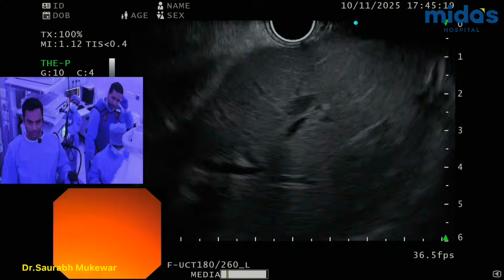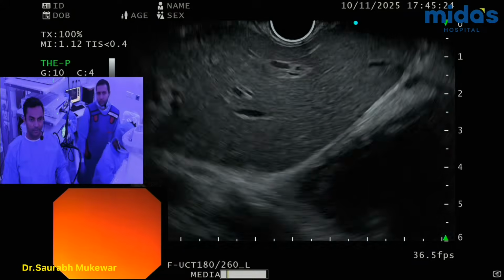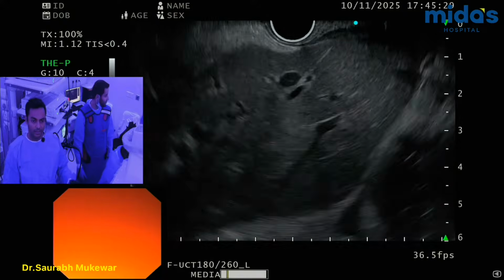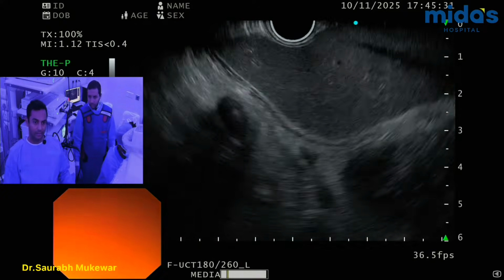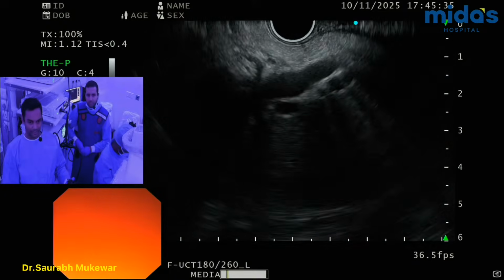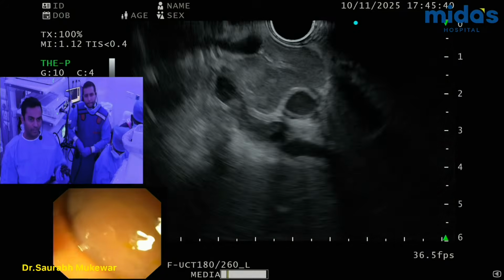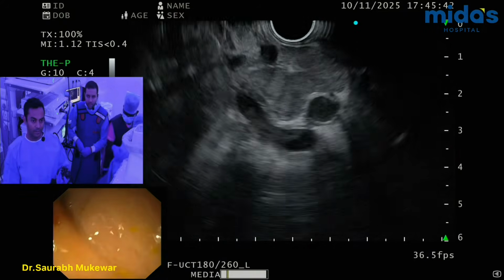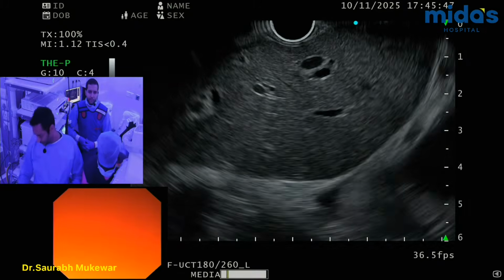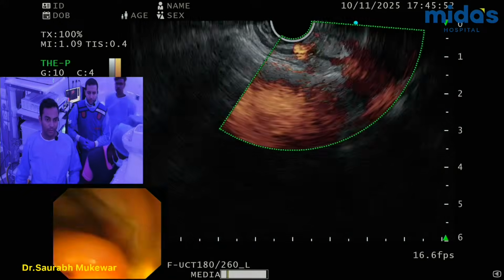Now let's see. Sorry, I'm going to interrupt 1 second. Yeah, I'll answer your question. So I want to see the left intrahepatic ducts as well. Oh yes, it's done. See, the intrahepatics are not very dilated. It said mildly dilated IHD on the report, so I didn't bother seeing. But yeah, they're not very dilated. So I would prefer CDS over a non-very dilated system. So yeah, I wouldn't prefer going in this one.